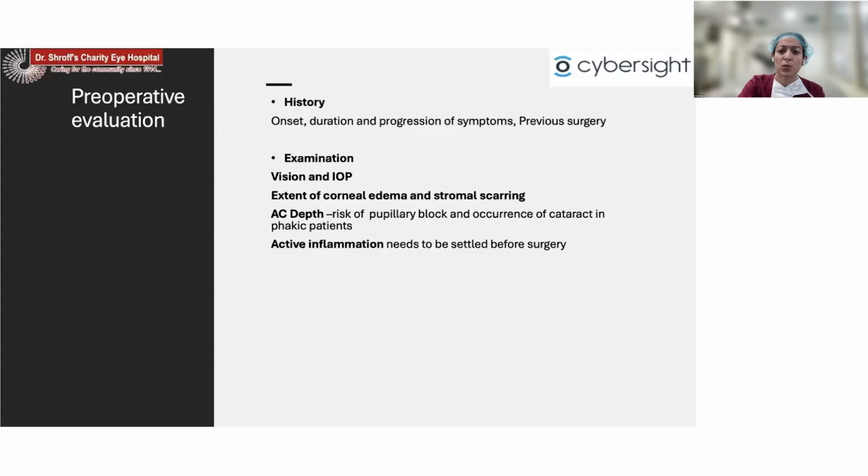Also, sometimes there may be associated pathology like a Descemet detachment, which may be correctable by just a small procedure like a descemetopexy. Sometimes there is edema, which may require just a trial of steroids. So about 6 to 8 weeks post-cataract surgery should be the minimum wait period before you decide that the patient needs an endothelial keratoplasty, unless you can certainly tell that there is no DM in the eye at all, and so there is no scope of improvement.